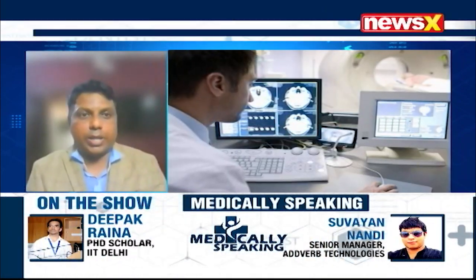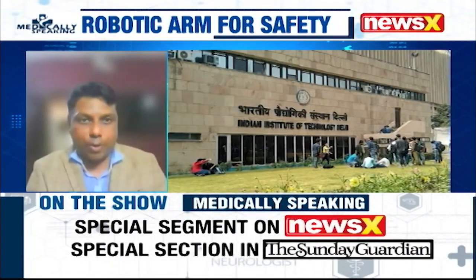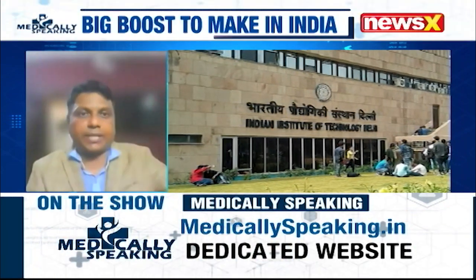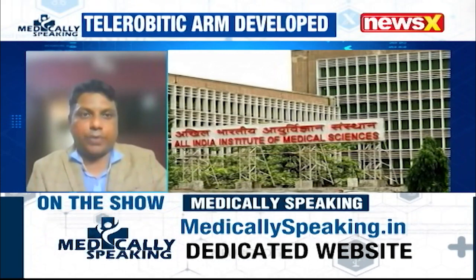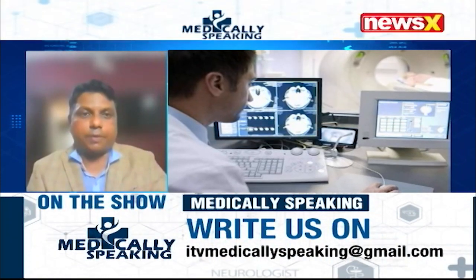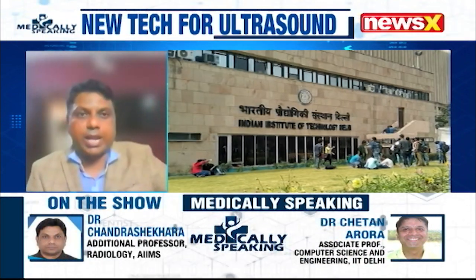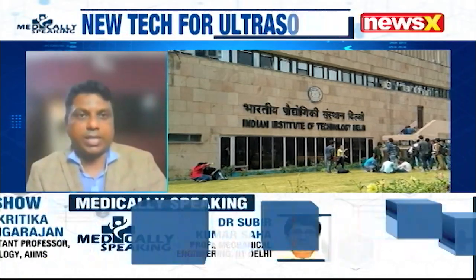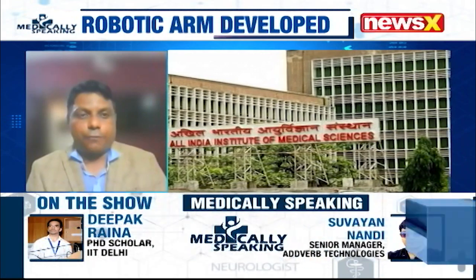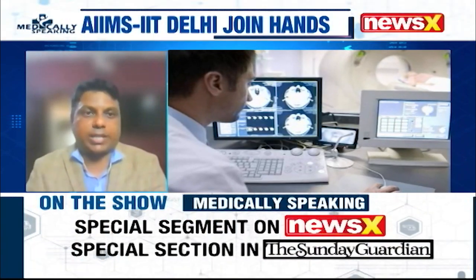The next step is to do the ultrasound quite away from our room, that is, in the wards during emergency hours. Supposing a patient comes during an emergency at night, where the availability of doctors and experts may not be there, we can set up the robotic machine over there, and we can interpret the images sitting at our home, maybe at our office. If we can, then further we want to move this technology quite far away to the rural setup as well.